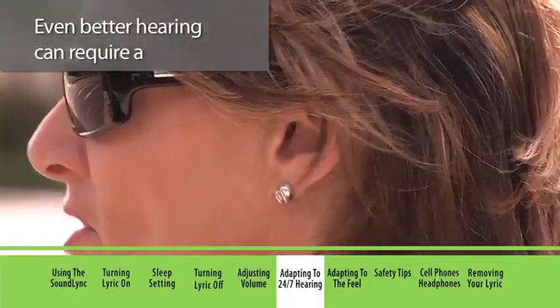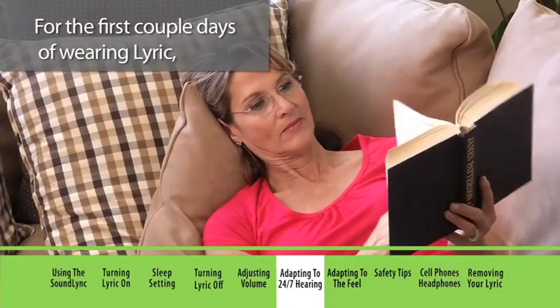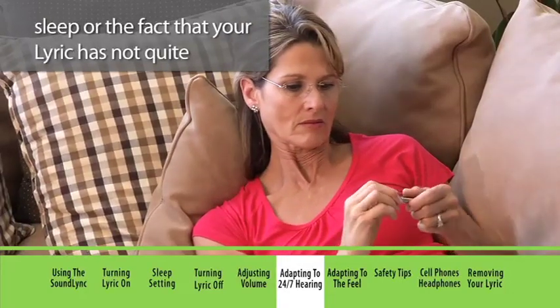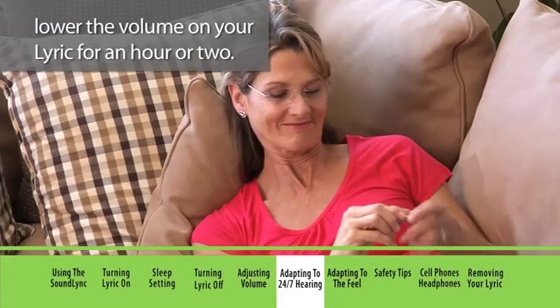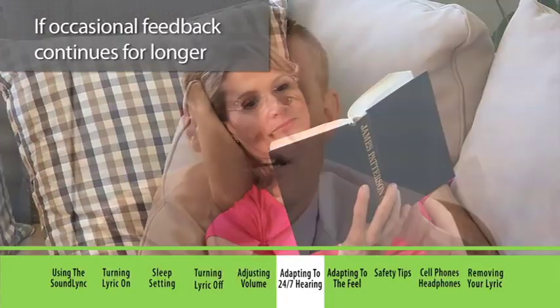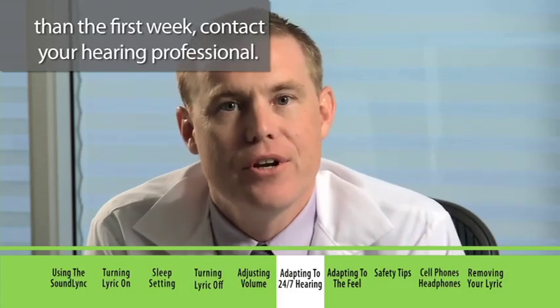Even better hearing can require a period of adjustment. For the first couple of days of wearing Lyric, you may notice a whistling sound called feedback. This can be caused by movement while you sleep or the fact that your Lyric has not quite settled into position yet. If this happens, lower the volume on your Lyric for an hour or two, then try to raise the volume to your comfortable hearing level. If occasional feedback continues for longer than the first week, contact your hearing professional.